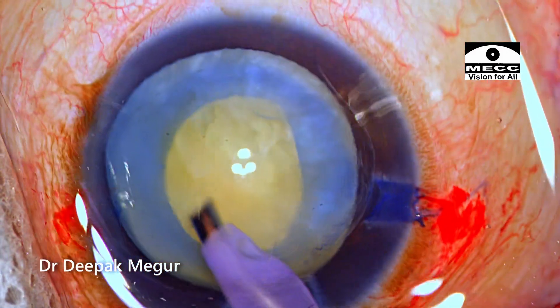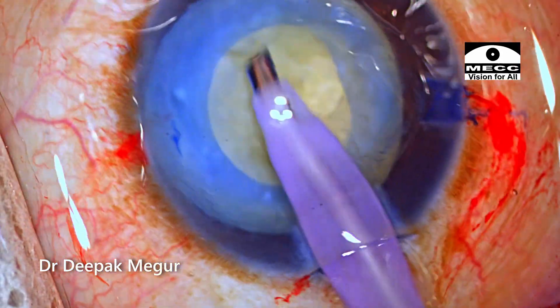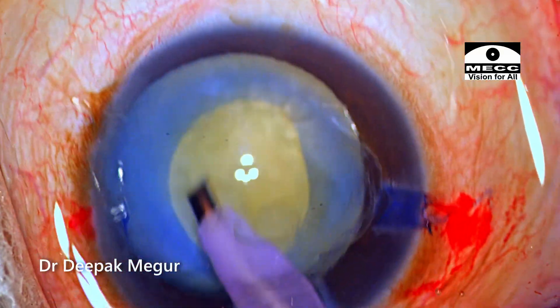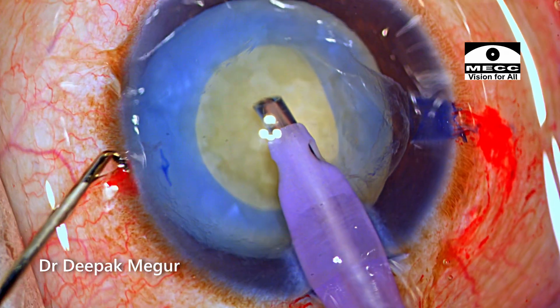These are not very healthy capsules, so we need to be aware of these facts. To prevent this from happening, we need to be conscious of the position of the chopper and follow some basic principles which will allow us to divide the nucleus without using any excessive force.